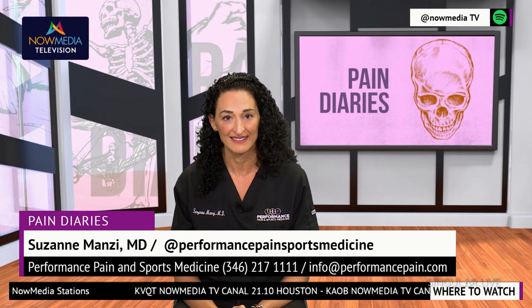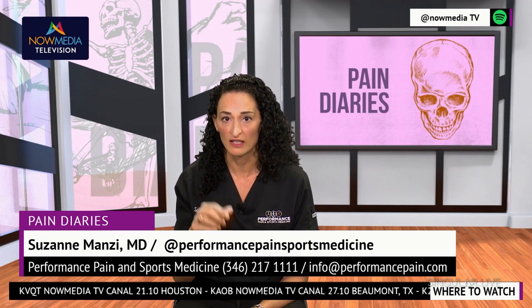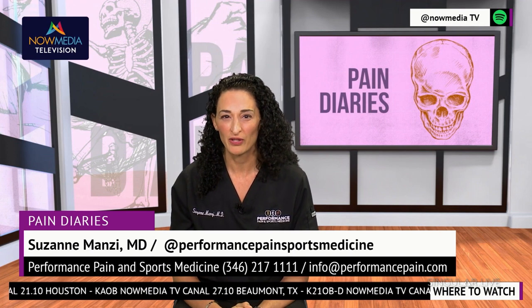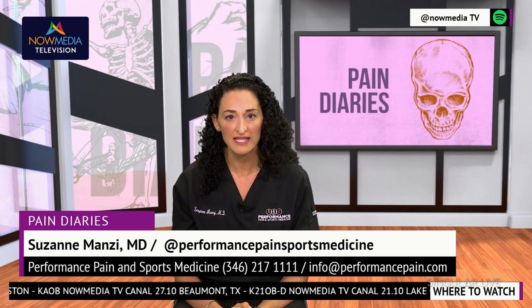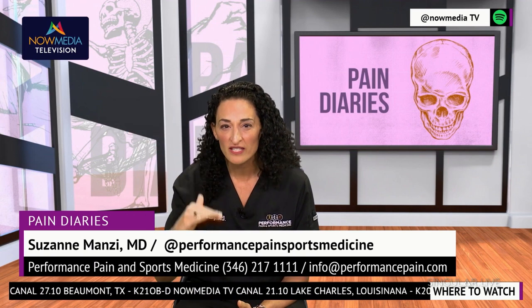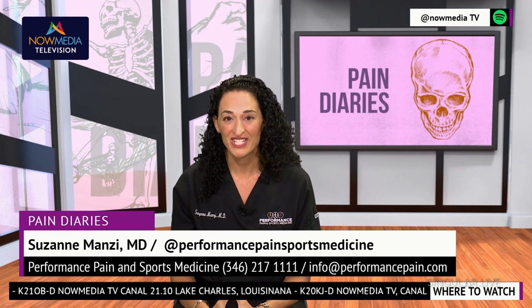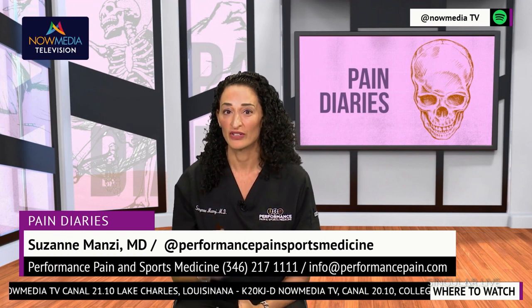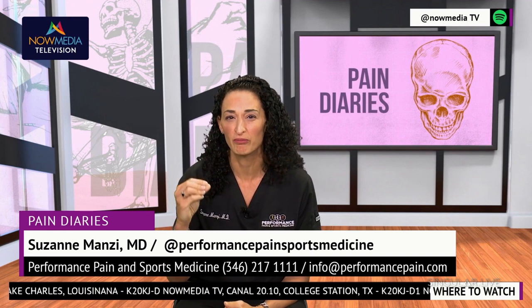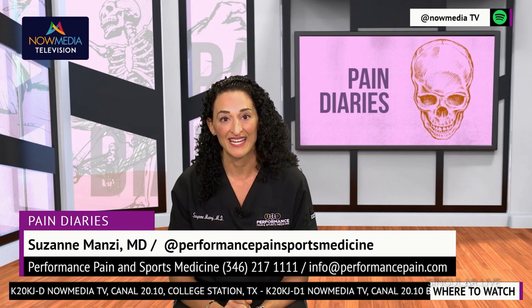Spinal cord stimulation involves a small device that's implanted under the skin in the low back and up into the spinal area. The device sends electrical impulses to the spinal cord, which alters the pain signals that travel from the nerves all the way up to the brain. This can reduce the feeling of pain and provide relief to the patient. Spinal cord stimulation involves a trial period, again, during which a temporary device is implanted to ensure the patient experiences relief before a permanent implant is then put under the skin.